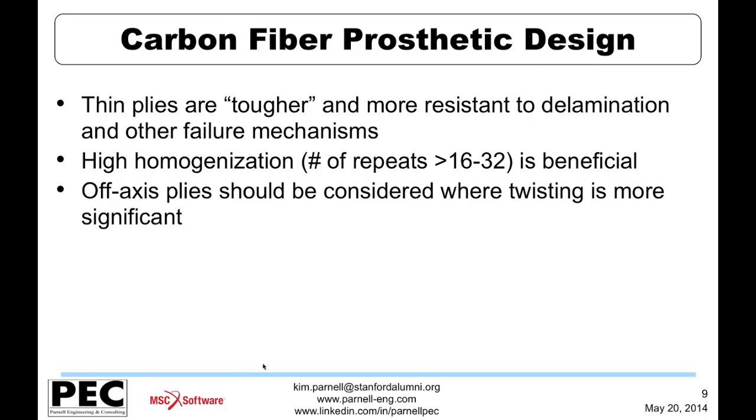So let's talk a little bit about carbon fiber prosthetic design in general, what we see here on these components. These particular components are predominantly unidirectional composites. So that means that the fiber direction, they have a single fiber in them, a single strong axis, and these plies are oriented for these components all in the 0 degree direction, or along the length of the foot or the heel member. That's the direction of primary bending.